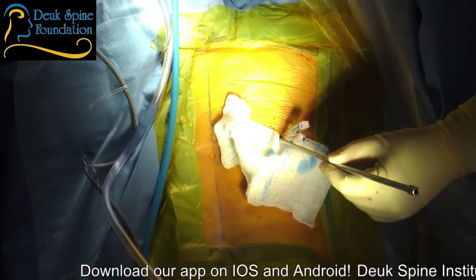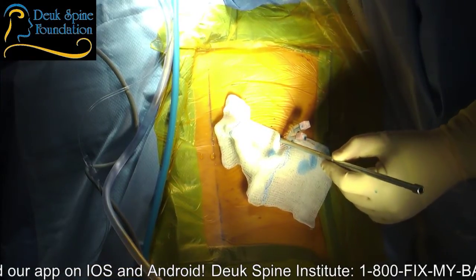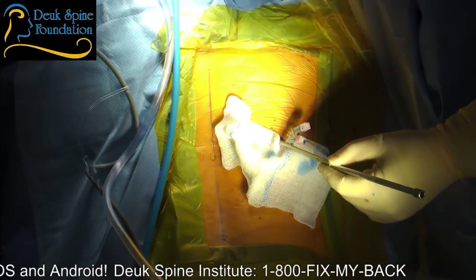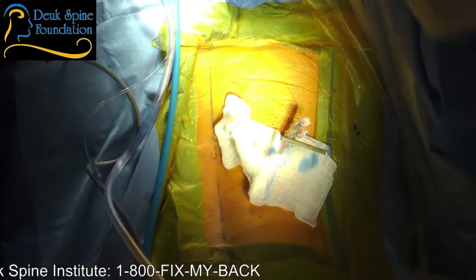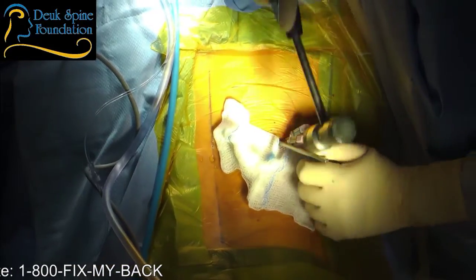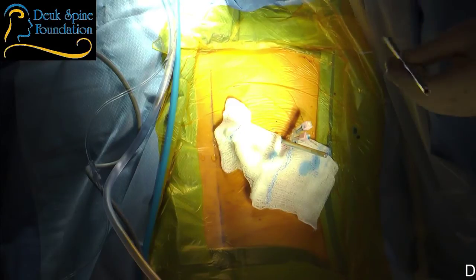All right. So at this point, we have the 3 needles in, and I've taken 1 needle out, replaced it with a guide wire. The guide wire guides the dilator, which is what I'm actually using to get into the disc space shot at L5S1. So the dilator is what creates the path or trajectory for the tube.